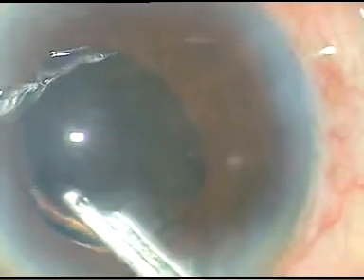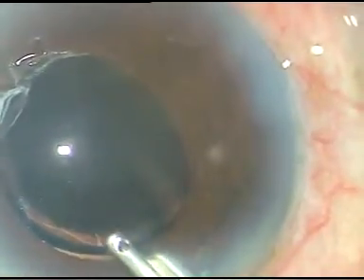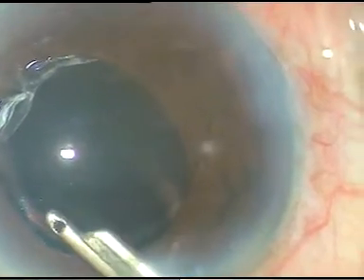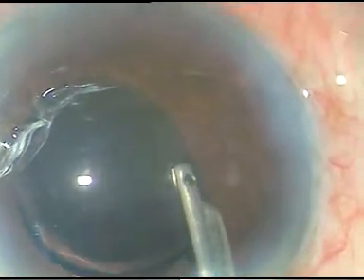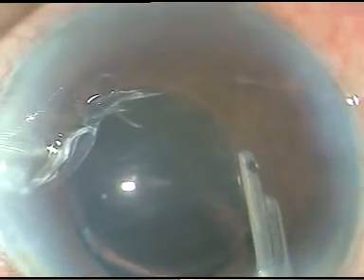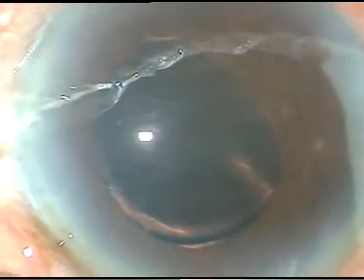Now I go in front of the intraocular lens and just flush out the viscoelastic substance, and that's it. It is looking nice now, quite acceptable.